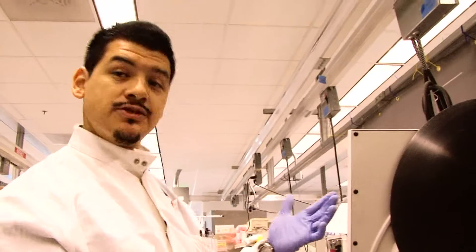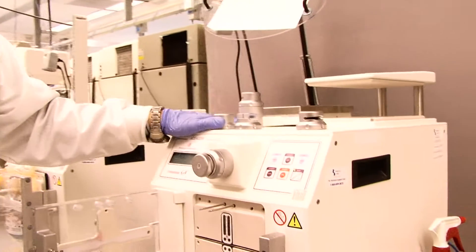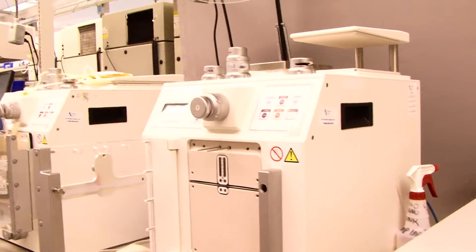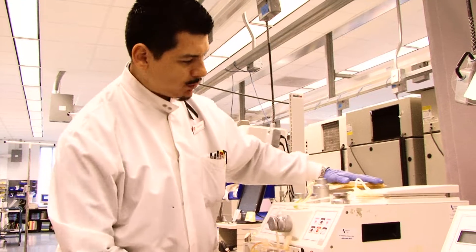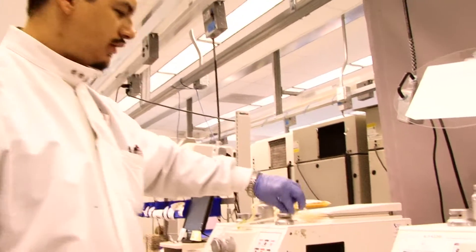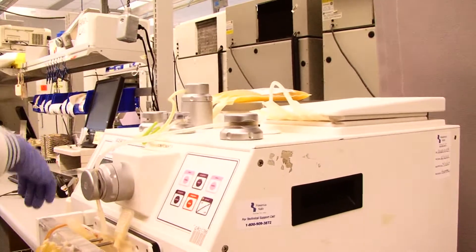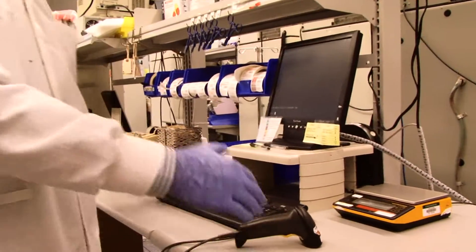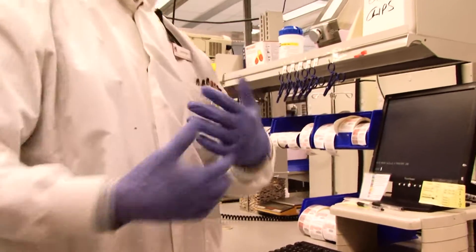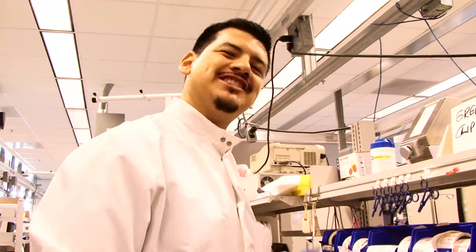After we're done spinning it, we have to do what's called expressing it — separating the plasma from the red blood cells. We have these robots right here that'll do that for us, and we also have manual expressors. We put the unit on here, put the tubing through all those places, it separates the plasma from the red blood cells, and then right here we input the anticoagulant and nutrients into the bag. We bring that over here, seal it, record that in the system, and then distribute the products wherever they need to go.